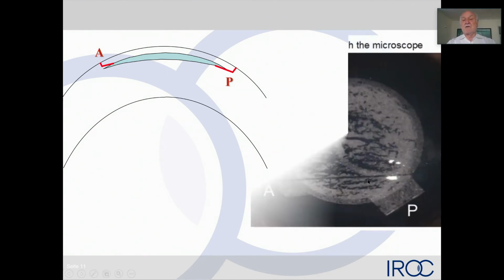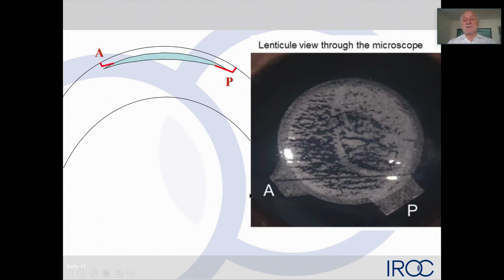Now, the last thing I would like to add is something that I feel is very important. If you have your cornea and you create the lenticule, you would like to have two different approaches. Why is that? Remember, if you go into one port, you always have the problem: am I on top of or below the lenticule? For beginners, it's a really difficult decision. For people like Jod, who has done thousands of these, it's not a big deal. But for people who are starting with SMILE, they may benefit from these different ports, and you may see such a port that we did already 9 years ago. That is the anterior approach that ends up over the lenticule, and that approach that ends up below the lenticule. And with your spatula, you can very easily separate the two planes or levels, and you do not confuse them.